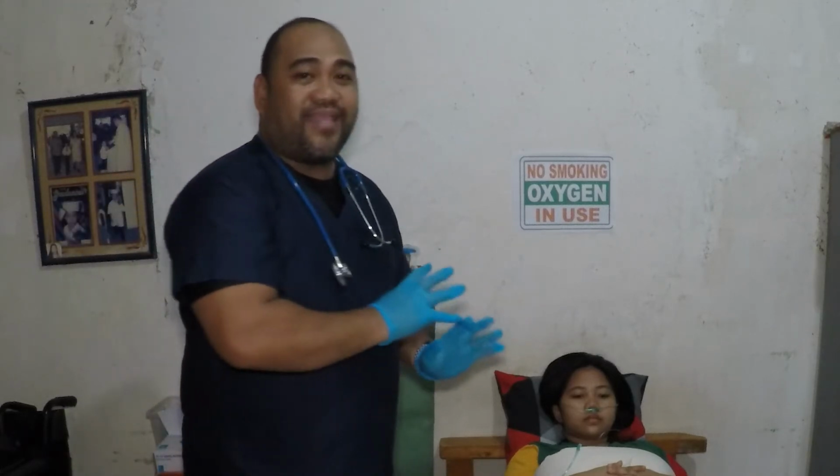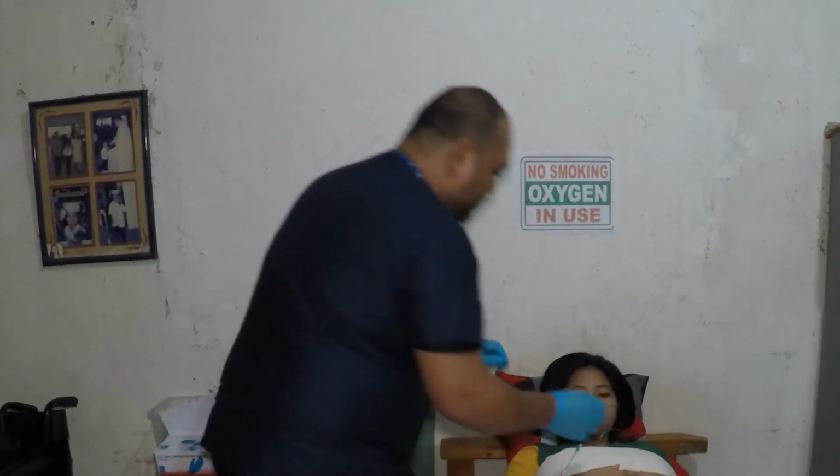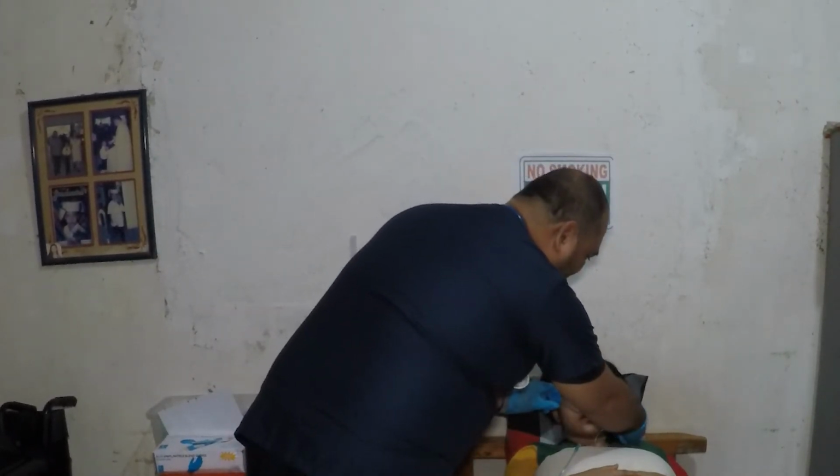So this time, I'll be removing now the nasal cannula. We'll be trying also the simple face mask. So I'll be removing this one.